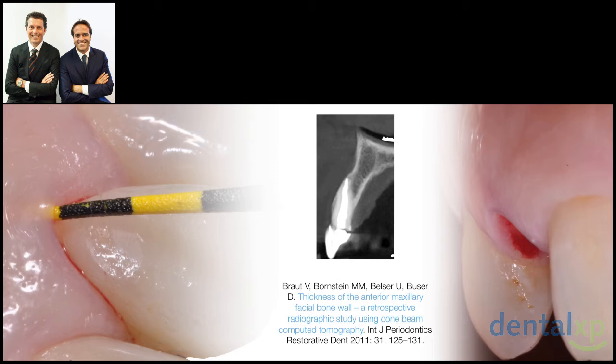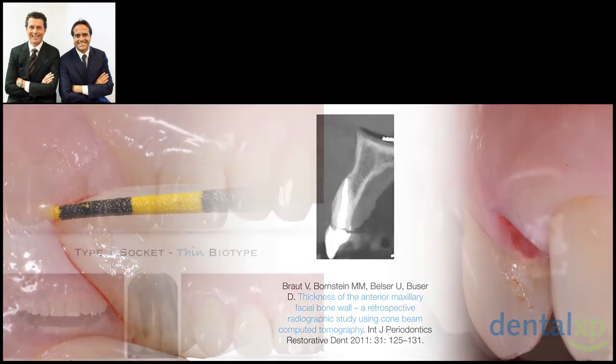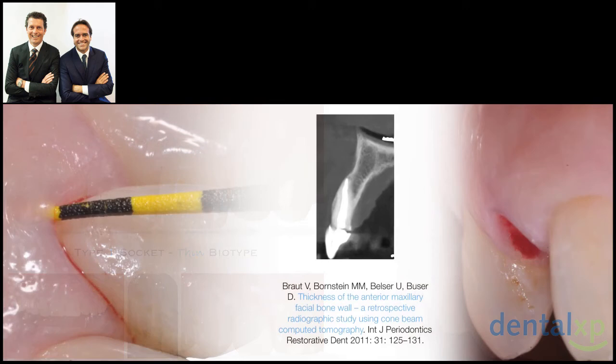So why not apply the partial extraction therapy technique in this specific case, so we can retain that piece of root in the buccal aspect, which will help us in maintaining the buccopalatal contour volume, and we will also avoid damaging the buccal plate. You see, each technique has its benefits and limitations, but also its guidelines, and so it's very important to have all these techniques in your clinical armamentarium to choose the best technique that fits properly in that specific patient. Sorry, I went back. Let me go forward.